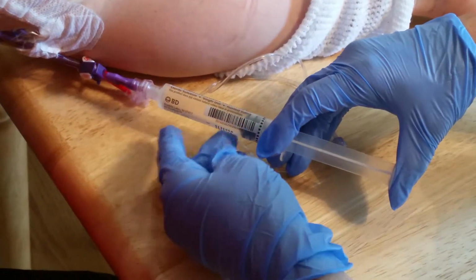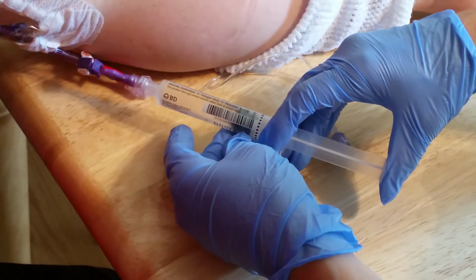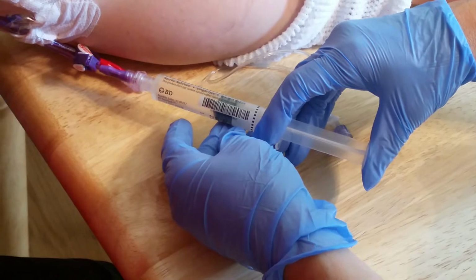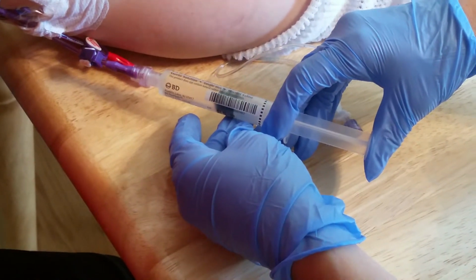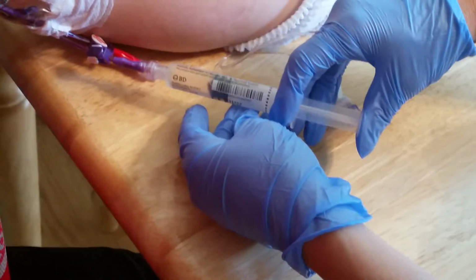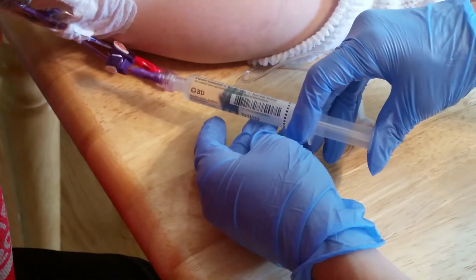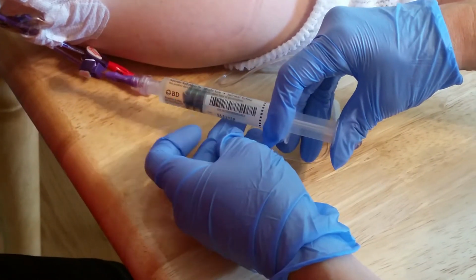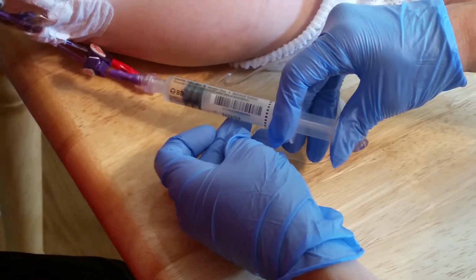I see there's a bubble down there, but until you get to the very end, that bubble's not going to come out. You taste it? Right. It says it's an everything. Being able to taste medication? So will it not even reach that because it'll just stop there that way? What, that little bubble there? Yep, I'll stop before we get there.